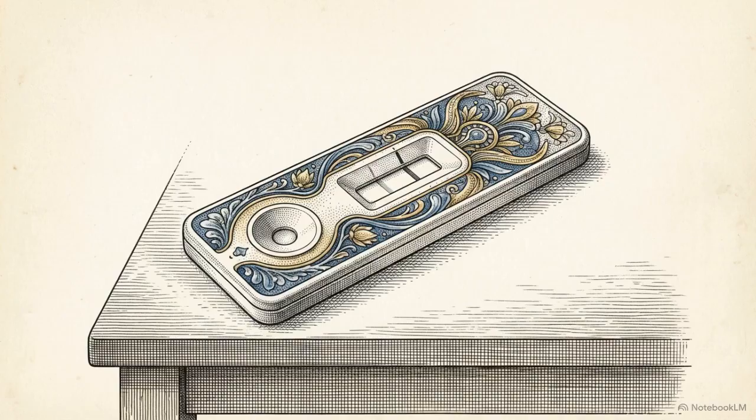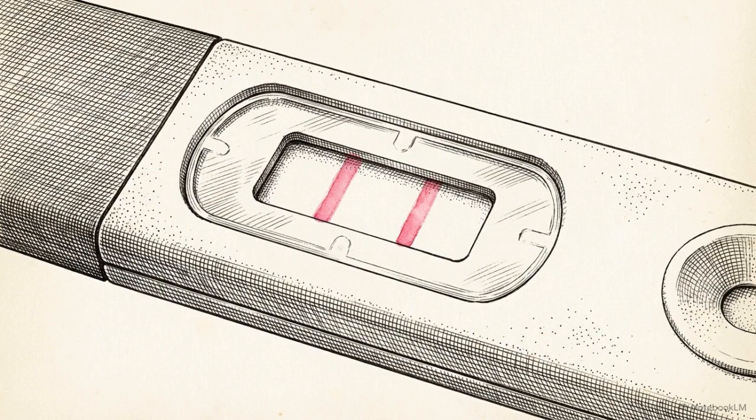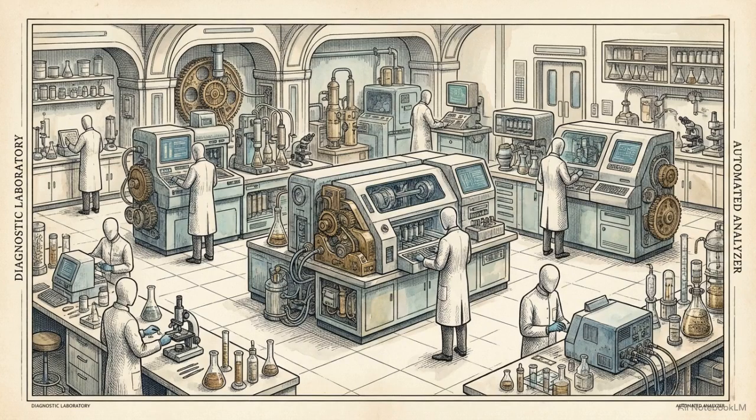The modern replacement relies on rapid recombinant immunoassays, like the Genius platform. These tests use specifically engineered viral peptides to deliver the high specificity of a Western blot, but at the speed of a rapid test. Clinical diagnostic validity is not static. Protocols must constantly adapt as new technologies mitigate the physical limitations of historical assays.